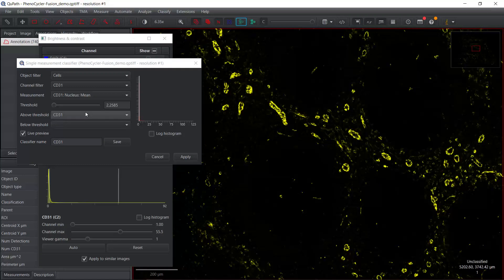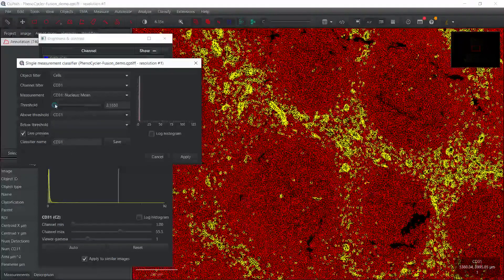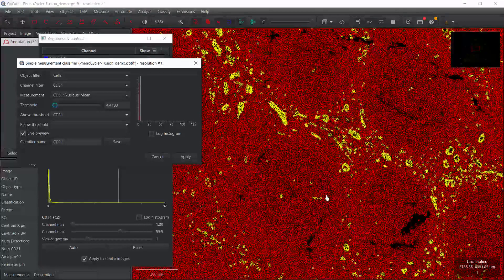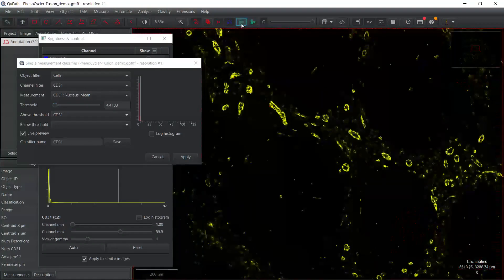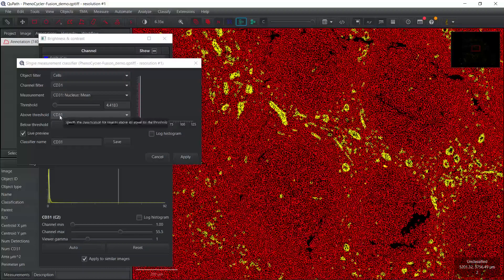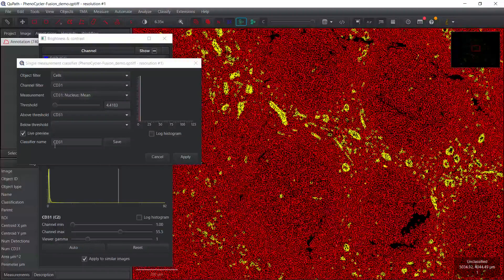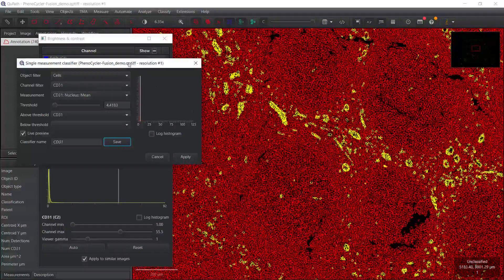We are not going to debate the background and the positive stain, just for demonstration. We can consider the bright stain as positive stain, so we can adjust the threshold. Now we switch on the segmentation again. Now we can increase the threshold. You can see the changes. Now the CD31 positive cells are the cells with strong CD31 staining. If we switch off the cell segmentation again, you can see the yellow cells match the strong CD31 staining. So now we can use this threshold for the CD31 positive cells. Then we can save our classification as CD31. You can see we saved the classifier as CD31.